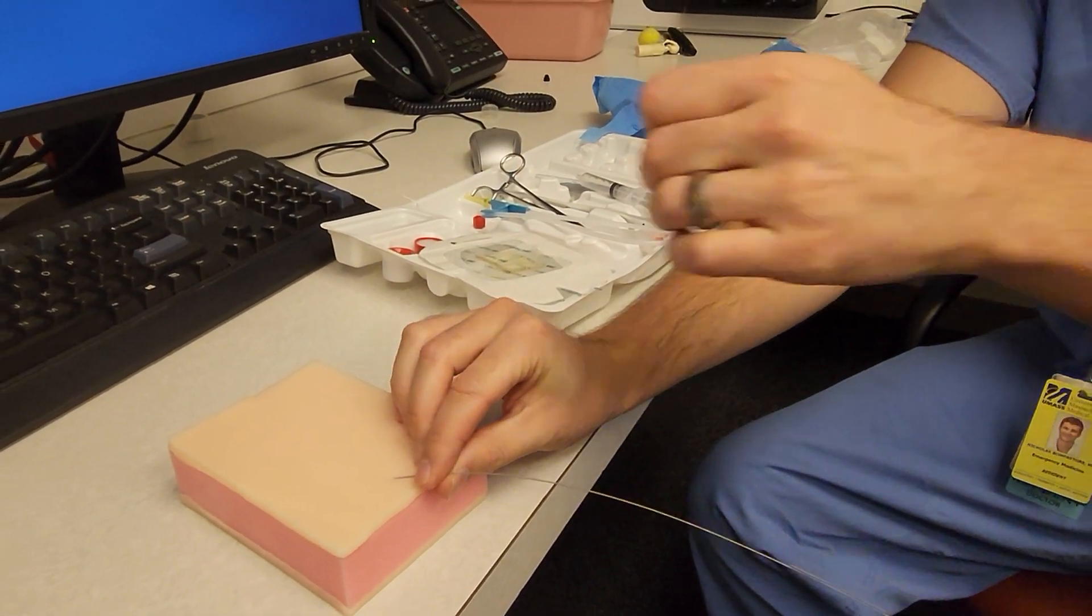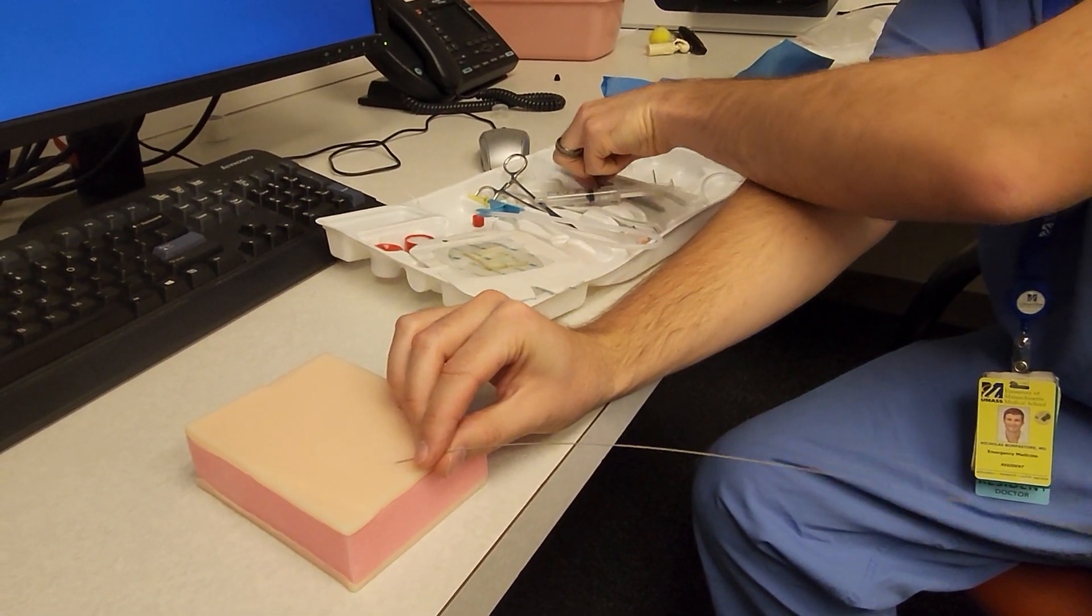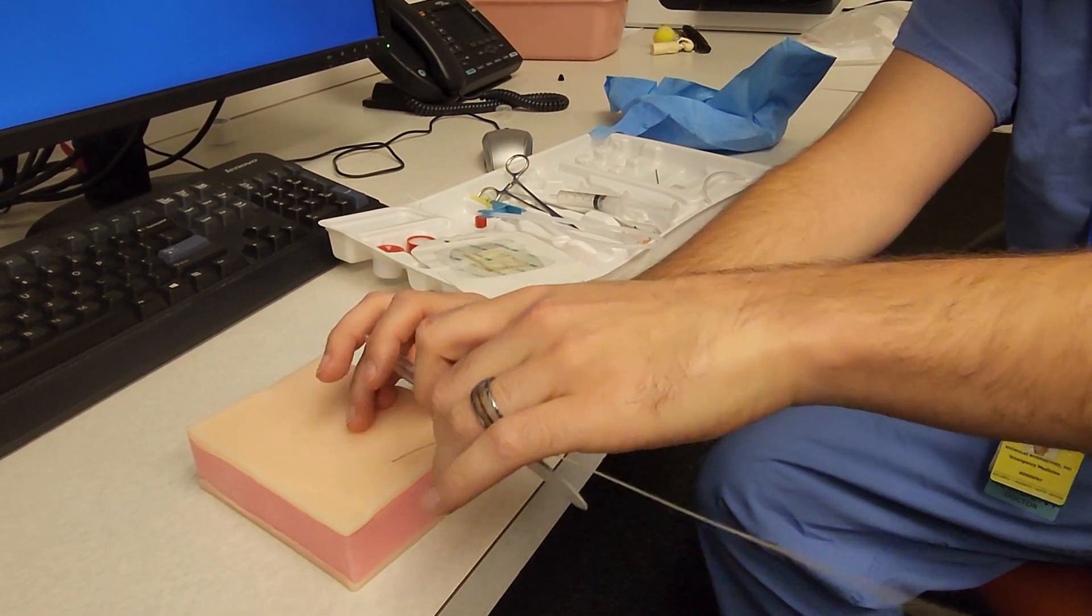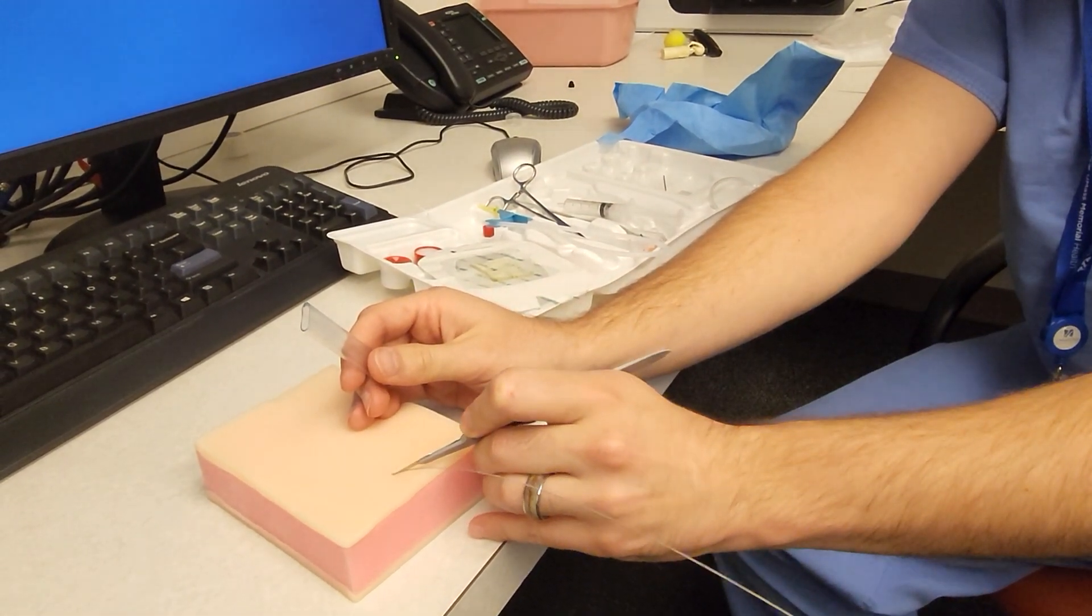Confirm placement with the ultrasound. Use the scalpel to make a slight nick.